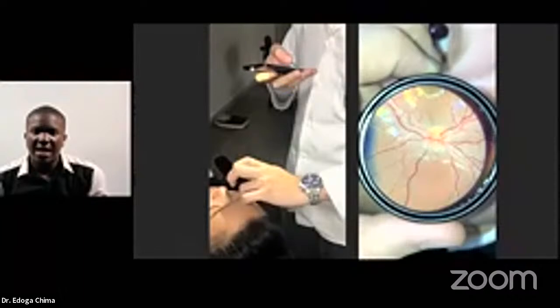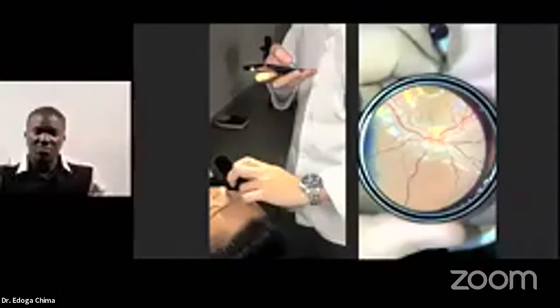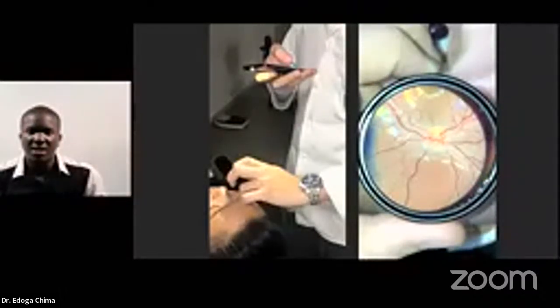And you can now make movements around the patient on the left side. You can also make movements around the patient on the right side.